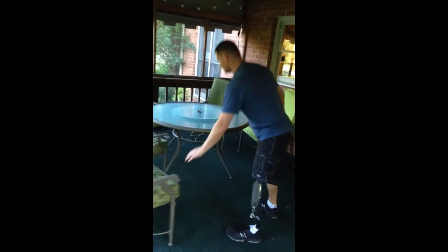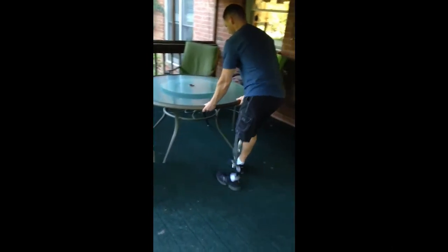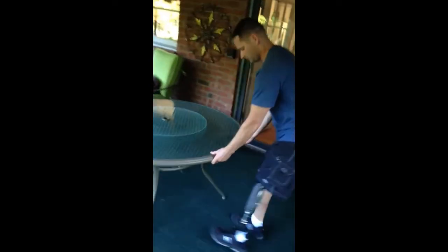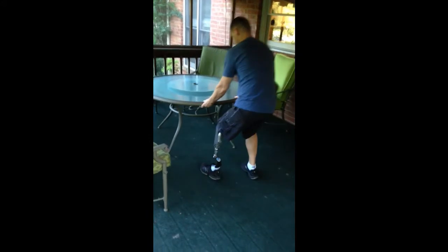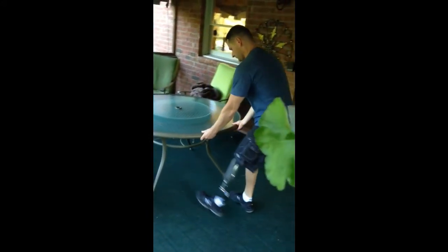Now, back to the little projects we don't always want to do, but we need to do. I want you to pay attention to how much he drives the prosthesis backwards, uses force to move this table with his prosthesis.